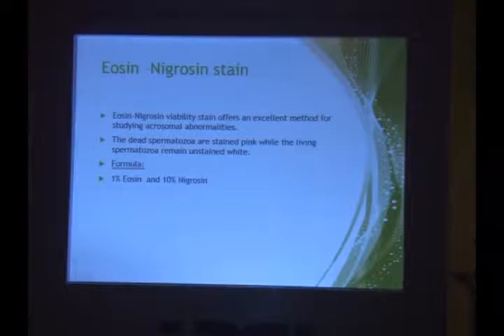Now we come to viability. If I have a non-motile sperm and I have just reported them as non-motile and non-viable, this patient is a patient of necrospermia. That means all sperms are dead. He has no chance either in a normal situation or with IVF or ICSI. No matter what, he will never conceive with his own sperms. That is what you report when you say all sperms are dead or non-viable.